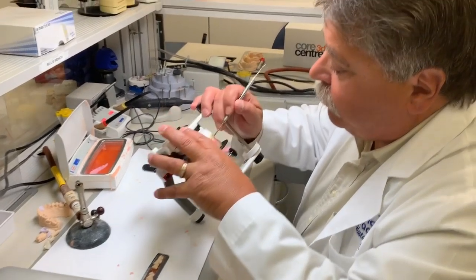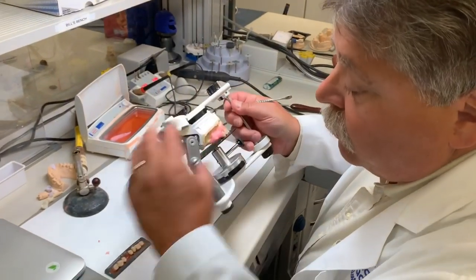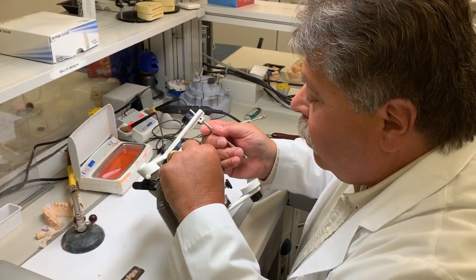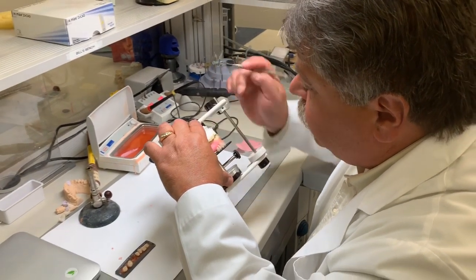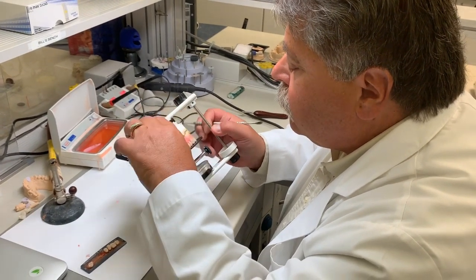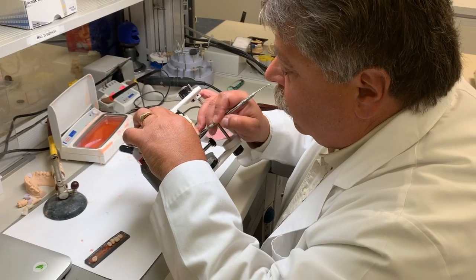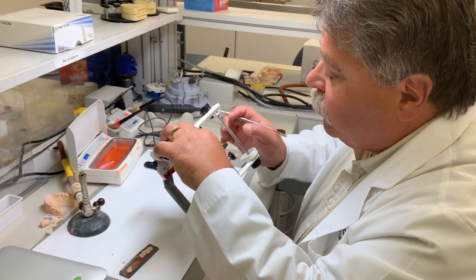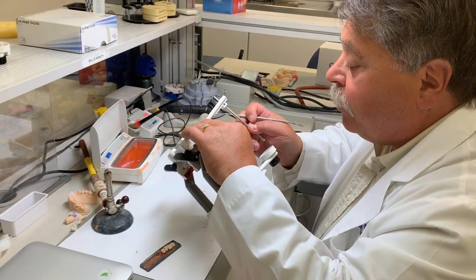And if the wax is soft, I can easily set all the whole teeth on all this side of the arch. And it goes relatively very fast. We usually spend a little bit longer on the front, the anterior teeth, because that's the teeth that people see the most. And we want those to look just the perfect way they want them.